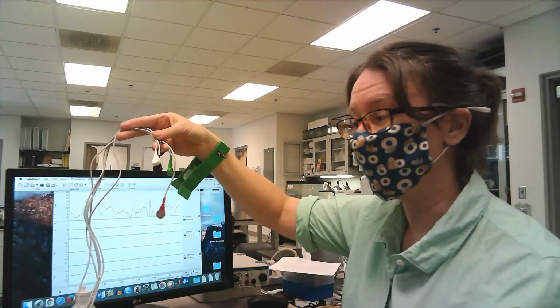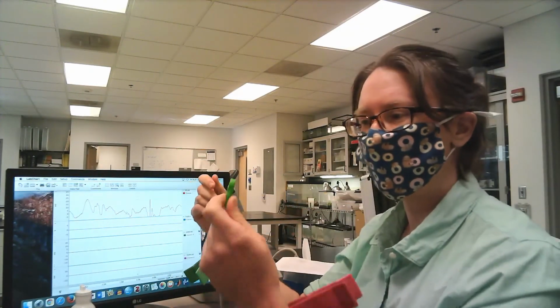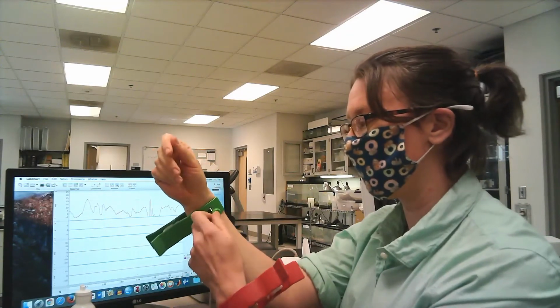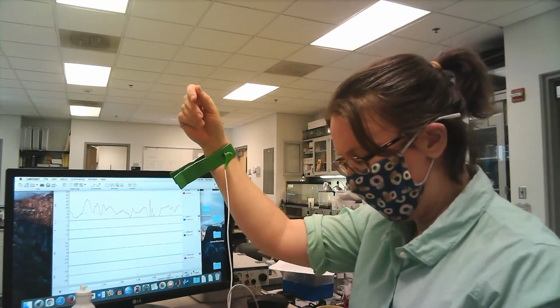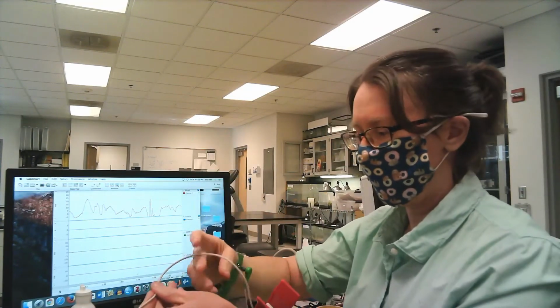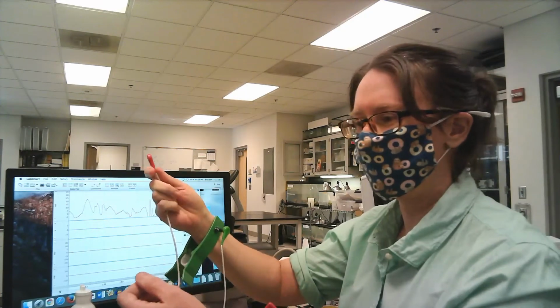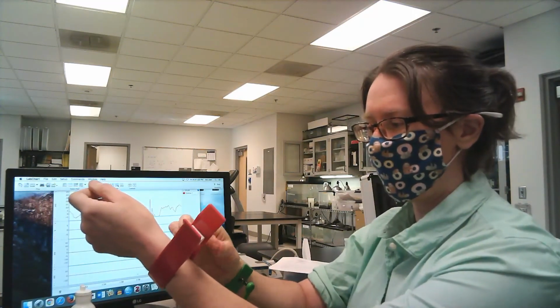And these are all color-coded, and so we're going to take the color-coded lead, this one's green, and it actually just snaps right on to the end of this clamp unit. And the same thing with the red lead. So this red lead's going to just clamp right on to this wrist unit. Okay?